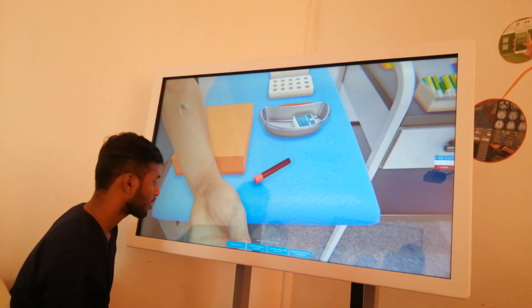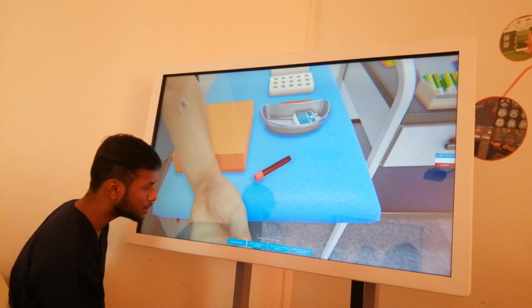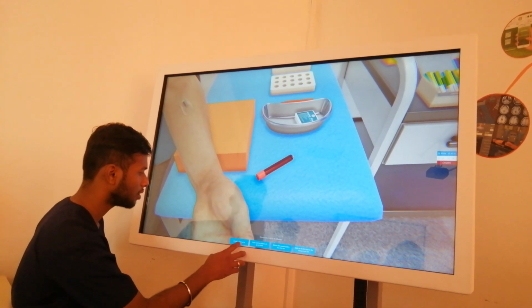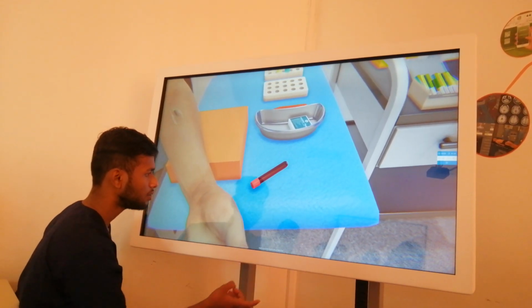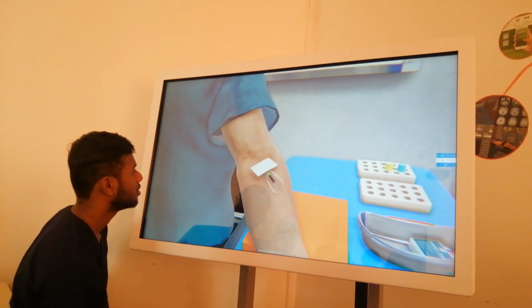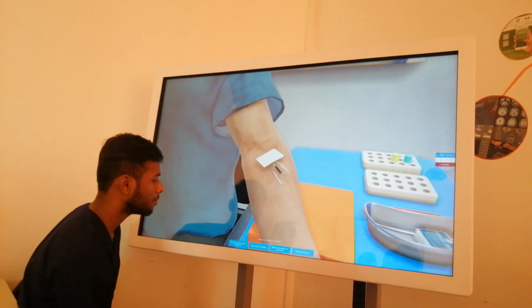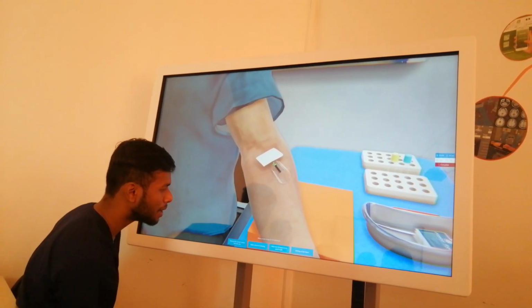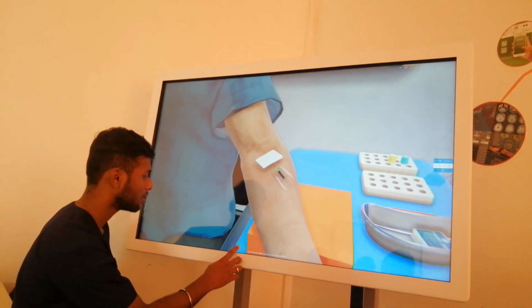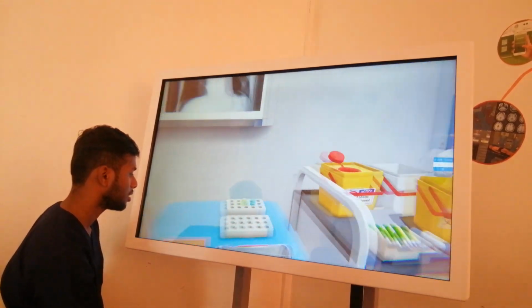What process should be the following? Labeling of test tube. Make sure that patient is in good health. Remove the vacuum system from the vein. Apply an alcohol wipe to the vein puncture site. Apply an alcohol wipe to the puncture site. What process should be the following? Remove the vacuum system from the vein. Apply a pressure dressing. Make sure the patient is in good health. Labeling of test tube. After the last tube is filled, remove the needle holder from the vein.